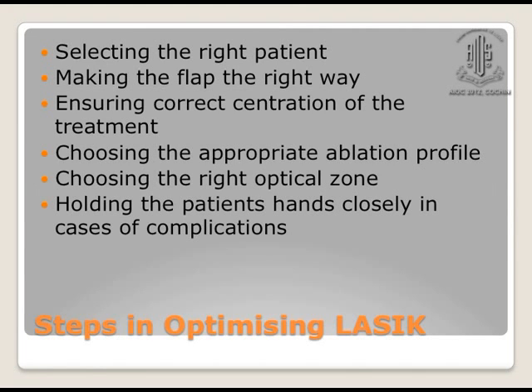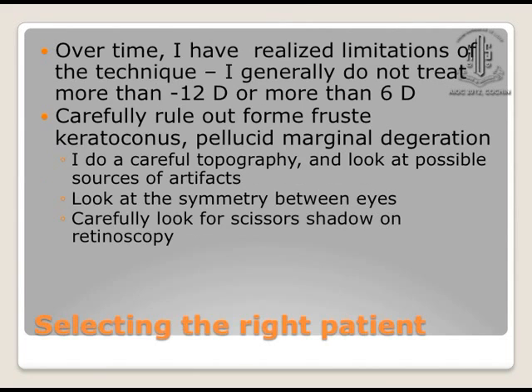So steps in optimizing LASIK start right from pre-op, continue intraoperatively, and require a lot of hand-holding if the patient is in trouble post-operatively. So we start by selecting the right patient. Over time, I have realized that there is a limitation of the technique, and it's not generally a good idea to treat more than -12 on the myopic side and +6 on the hyperopic side.